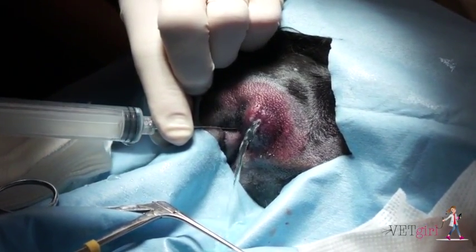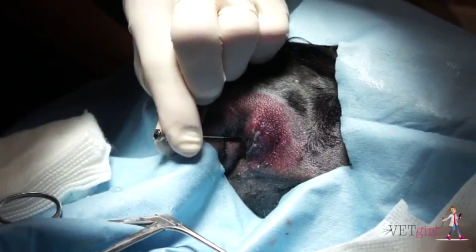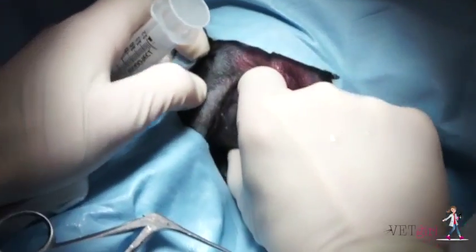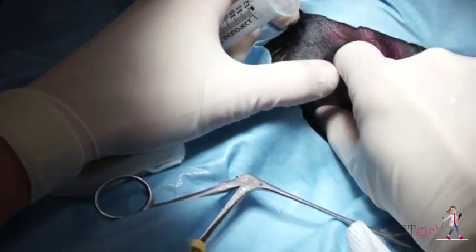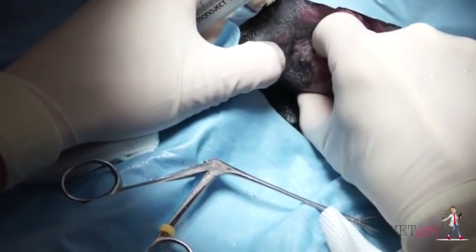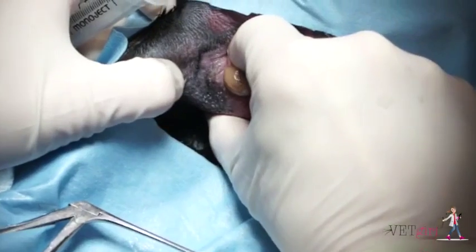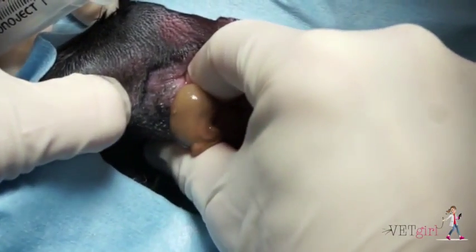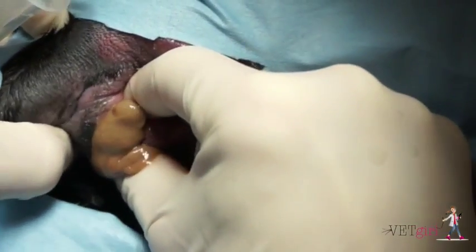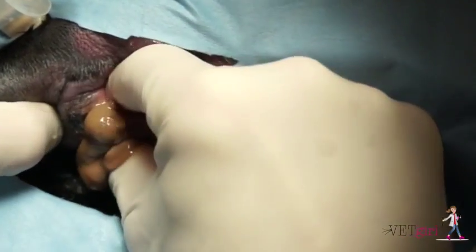Make sure to express the contralateral anal gland to empty it — it's potentially affected also. This one's a juicy one, which is why we always like to put the affected anal gland abscess on the upside so the contralateral anal gland contents don't get into our surgical opening.